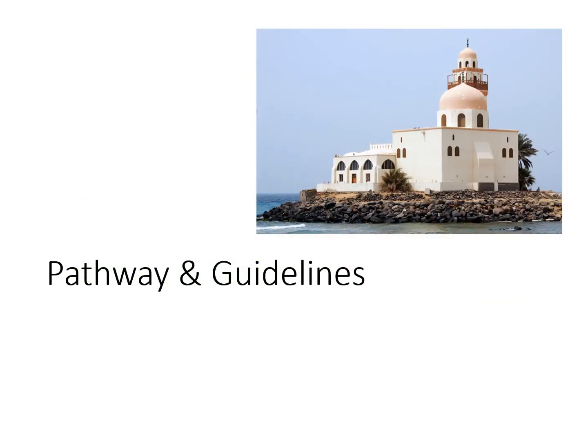So that's kind of how it all works. We've talked about the multiparametric MRI. We've talked about PI-RADS 2.1 and how the scoring works. So we've got this wonderful tool. How do we actually fit that into clinical practice? How does it work in the real world?